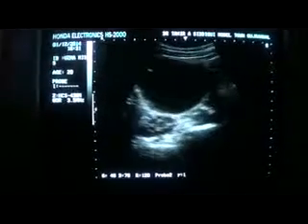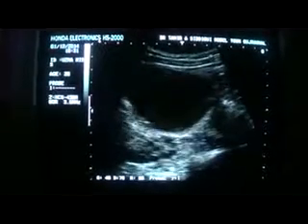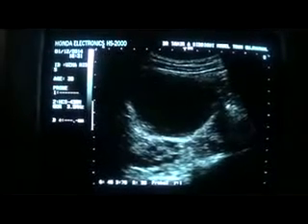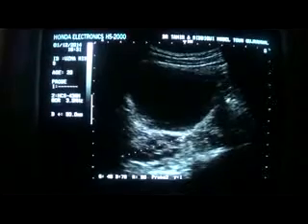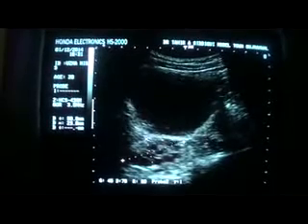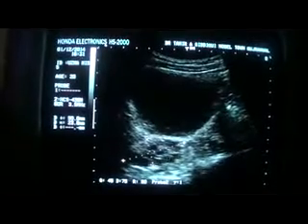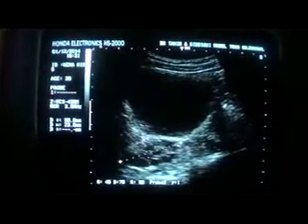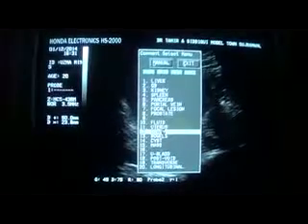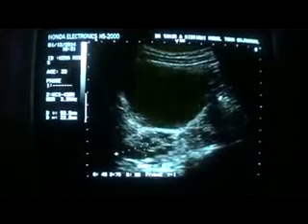This is our patient, female, 16 years, unmarried, and here I am showing you two structures. One is the urinary bladder in transverse section, and this oval structure is the right ovary. The right ovary is studded with developing follicles of variable sizes: 1, 2, 3, 4, 5, 6, 7. They are all arranged around the periphery, and there is a stroma also seen within it. This is suggestive of polycystic right ovary.